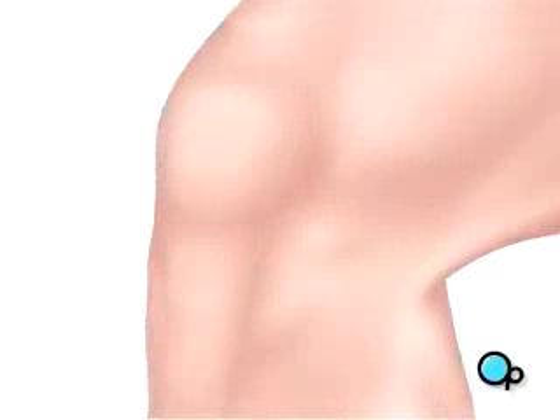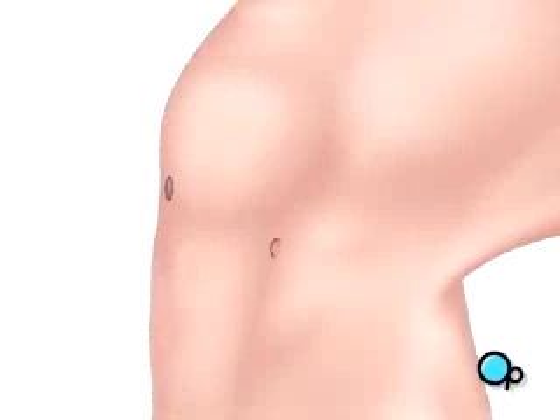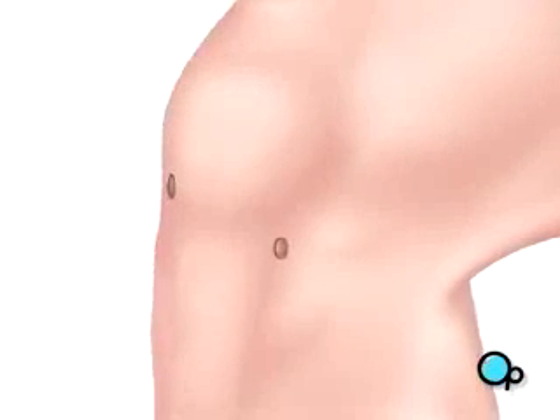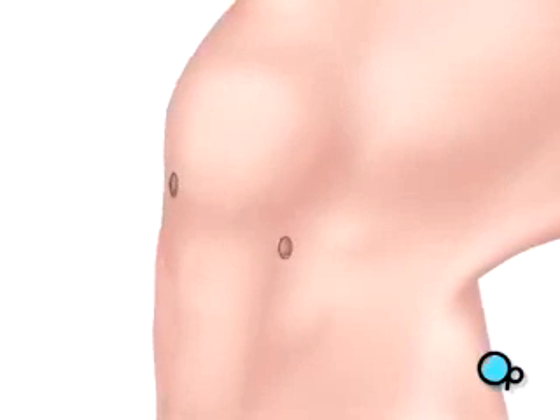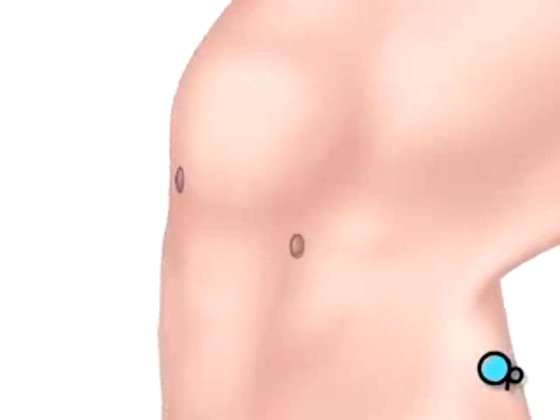To perform arthroscopic surgery, your doctor will make a few small buttonhole-sized incisions in the area around the knee. An arthroscope is a very small video camera that your doctor uses to see the inside of your knee and to guide the surgery.